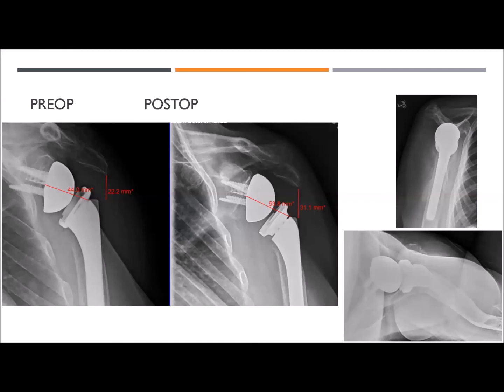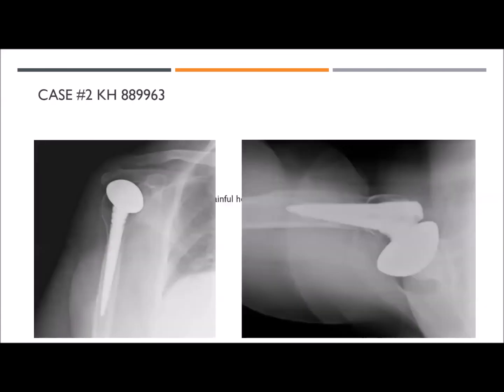The humeral and glenoid components were well fixed, and I felt like they were in a good position. To take those out and revise them would potentially create more of a problem, despite the fact that he does have some bone loss underneath the glenoid baseplate. It was very well fixed. And then again, with the deltoid wrap issue, I elected not to treat that specifically.